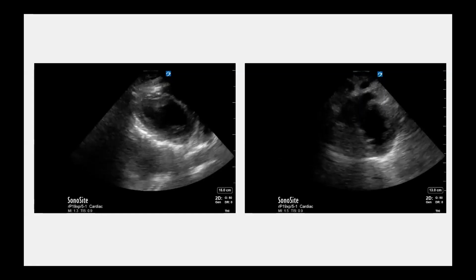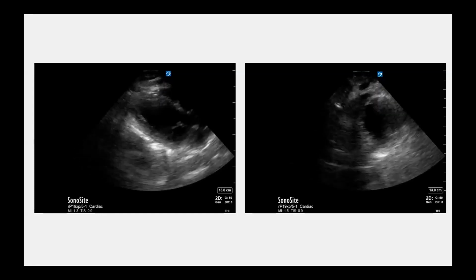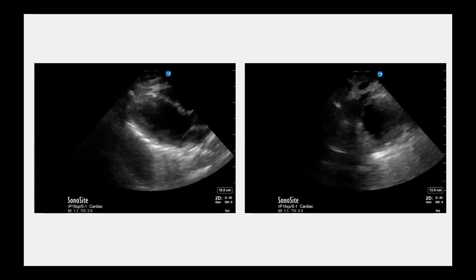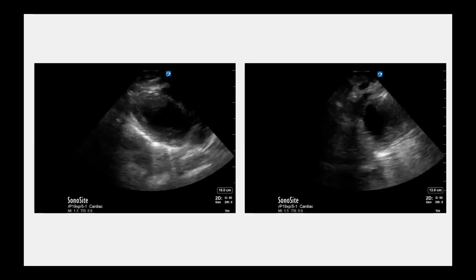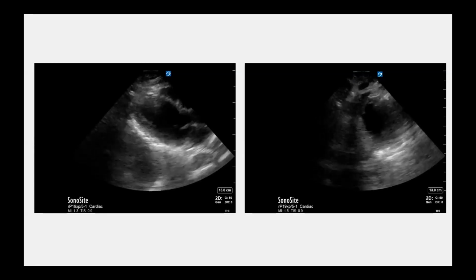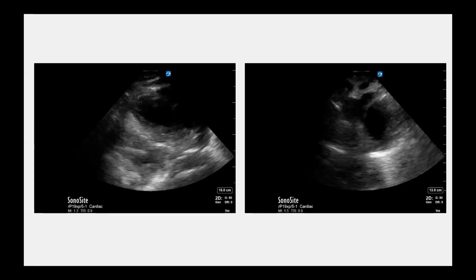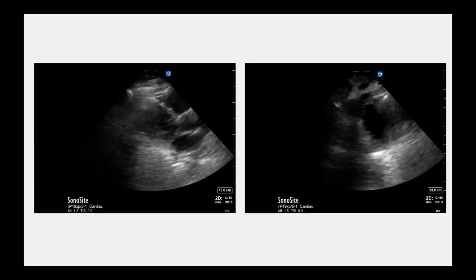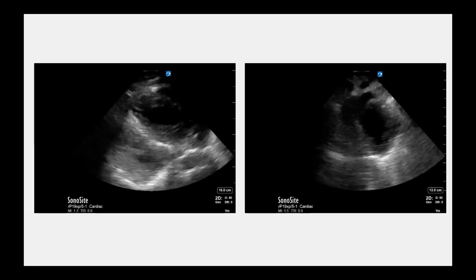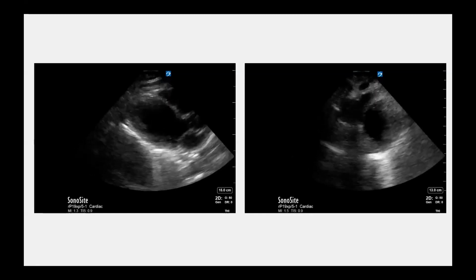Yes. So that pericardial layer envelops the heart and reflects just above the great vessels. So you would see it in between the DTA, descending thoracic aorta. I like to be more specific instead of just saying the aorta. Over here in this image with cardiac, you want to say the descending or DTA. So look at the DTA and look at the left atrium and look for that potential anechoic free space between the two, which we're not seeing here.